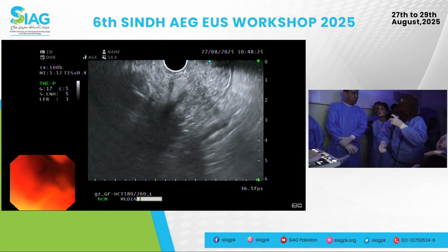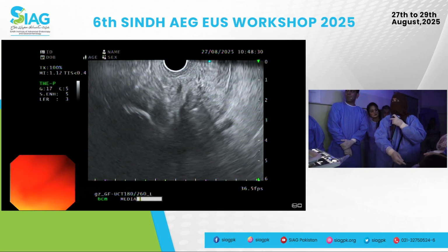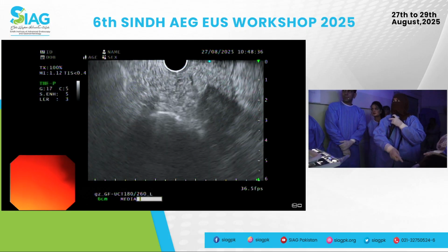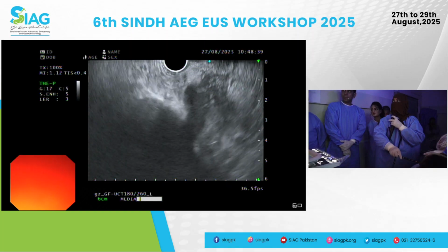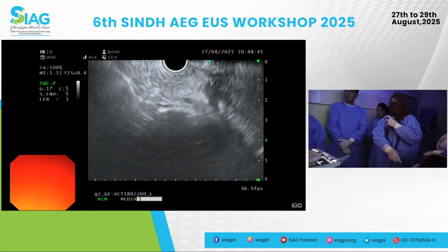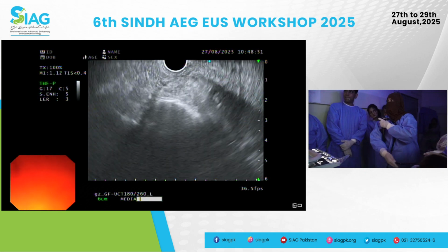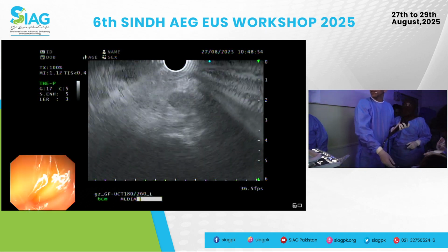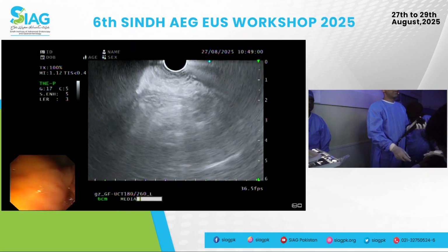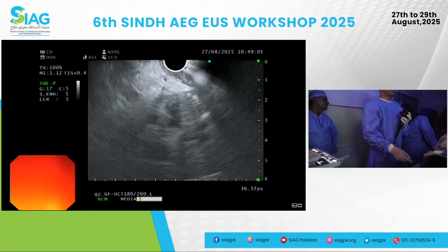I'll give you one more minute if you can just find the aorta. I will pull it back. Slowly. The scope will not fall back. Yeah, withdraw, withdraw, withdraw. Clockwise, keep clockwise. Okay, don't worry, that's fine. Let me just have a look. It came back. It's absolutely fine. This is the area of abnormality.